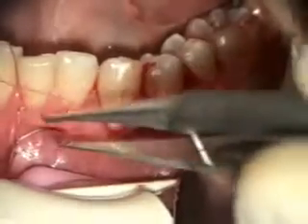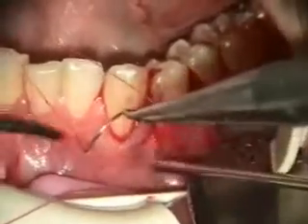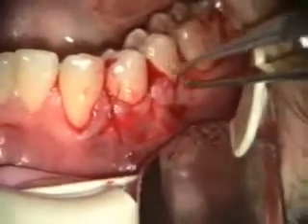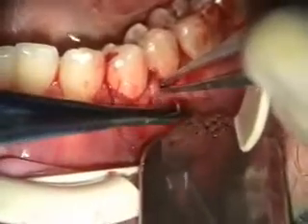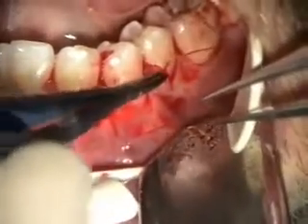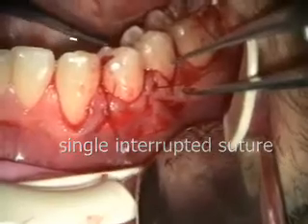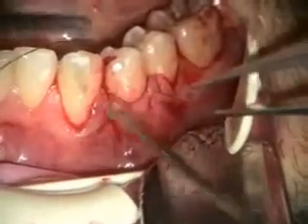Now in doing these grafts, one option is to suture the alloderm and then go back and suture the flap. In this case, you can see that I've been able to get the alloderm and the flap sutured at the same time, and I think that is fine.